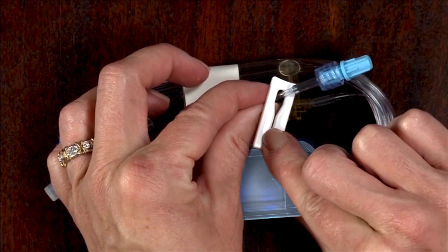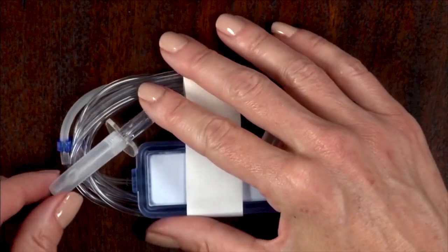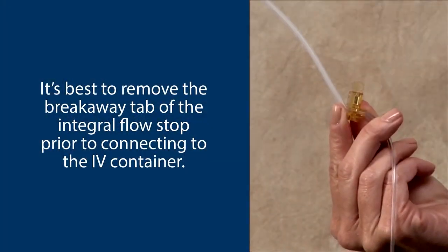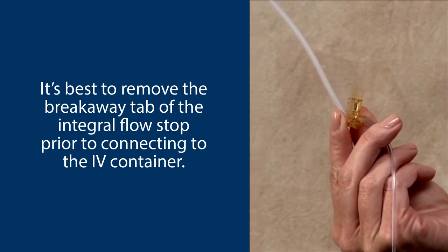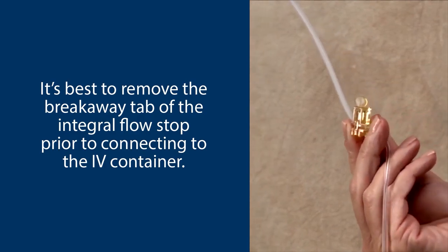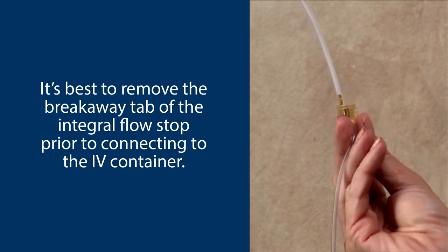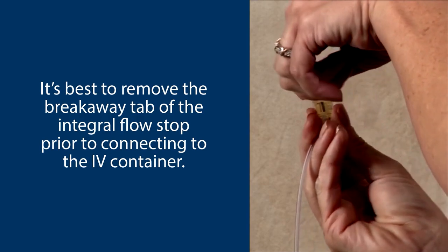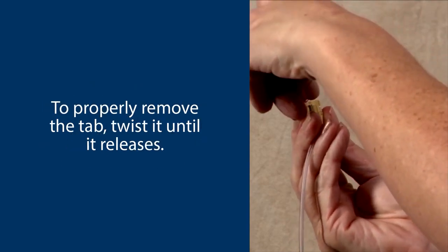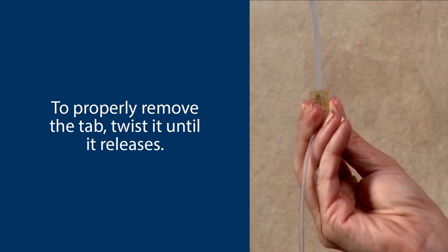The slide clamp should be in the open position, and the spike cover and tubing cap should be in place. Whether priming manually or on the pump, it's best to remove the breakaway tab of the integral flow stop prior to connecting to the IV container. When the tab is properly removed, the free flow protection will be engaged, preventing unregulated gravity flow. To properly remove the tab, twist it until it releases.